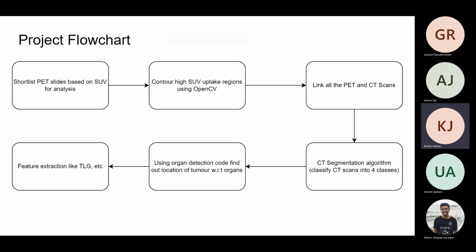Then he will potentially have multiple slices from the kidney which have SUV, and he will be able to bring them together and stitch them to identify the tumor, in three-dimensional space, because we also have the thickness of the slice.